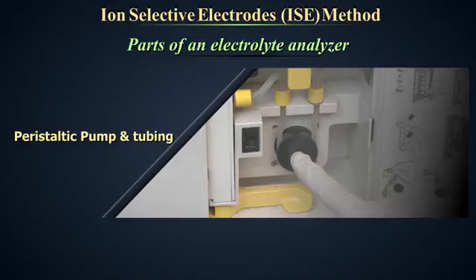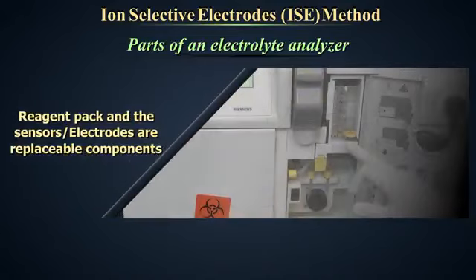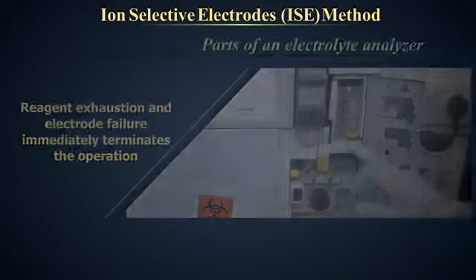Peristaltic pump and tubing. The reagent pack and the sensors are replaceable components of the instrument. Spares for both should always be kept as a backup, as both are critical for running the samples. Reagent exhaustion or expiry and electrode failure will immediately terminate the operation. Hence, to ensure smooth functioning, always keep these components in backup.